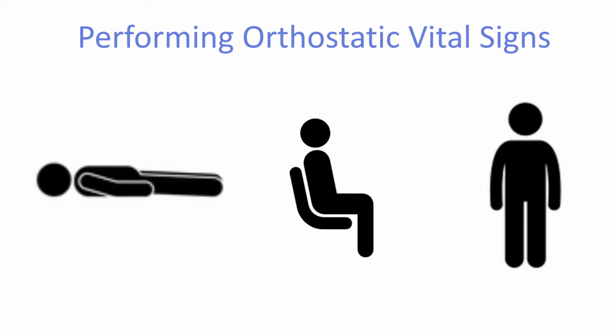If not, measure the patient's blood pressure and pulse immediately after the patient has stood up, and then repeat the measurement 3 minutes after the patient stands. Support the forearm at the heart level when taking the blood pressure. Assist the patient back to bed.